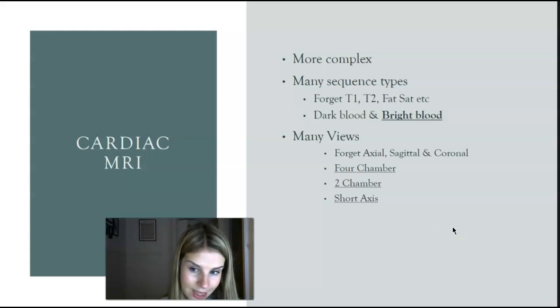Now I want to go to MRI. So it is much more complex, as are most things with MRI. It's something that takes a long time to learn how to do. It's a really interesting thing to do, one of my favourite things to do, but it is complicated, okay?